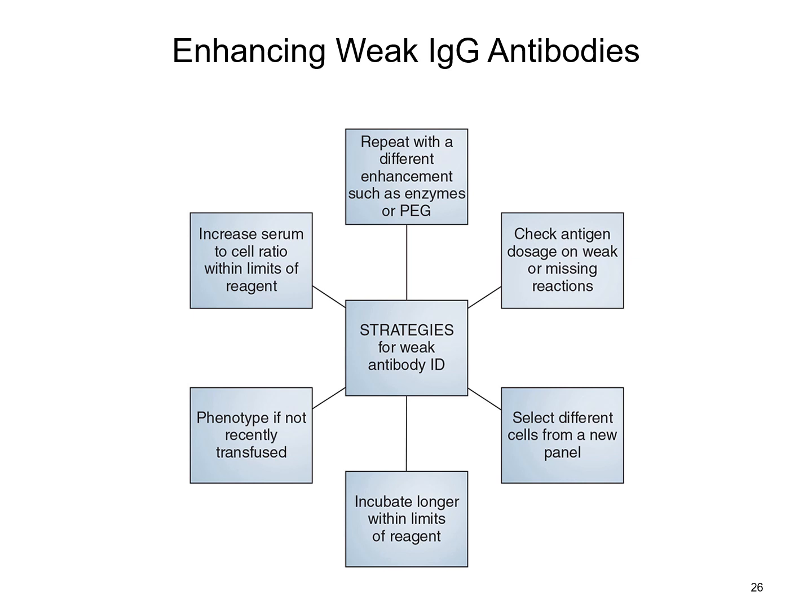Additionally, you could do things like phenotyping if the patient hasn't been transfused in the past 3 months, because again, we don't want to test donor cells, we want to test just the patient. And with that phenotyping, that could help us rule in or rule out antibodies. So if you're trying to narrow it down between a little c, a big C and a big E, and you phenotype and the patient has the big E antigen, then we know that they can't have the E antibody. So that helps further eliminate the possibilities, and allows you to more safely determine what to transfuse that patient.